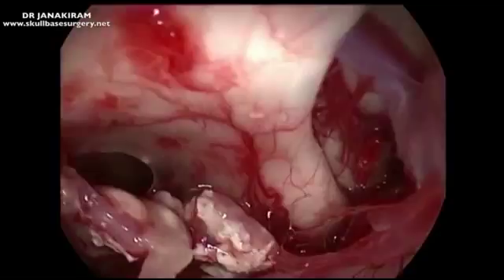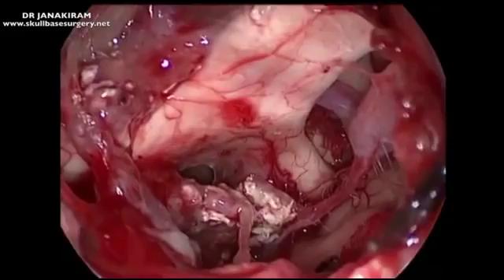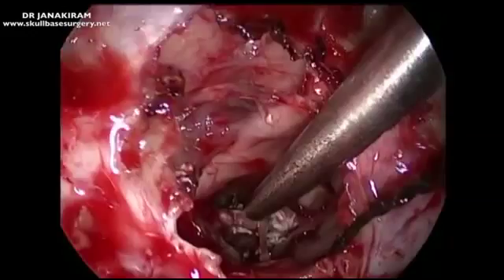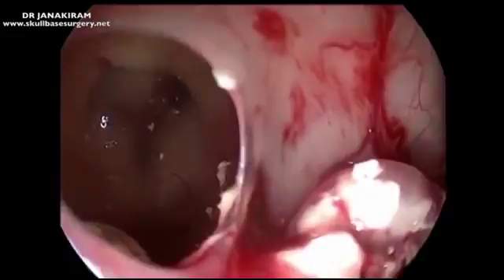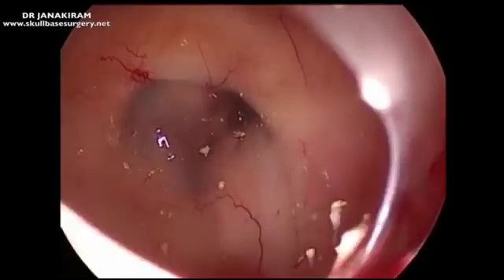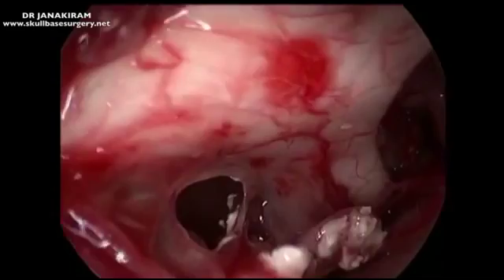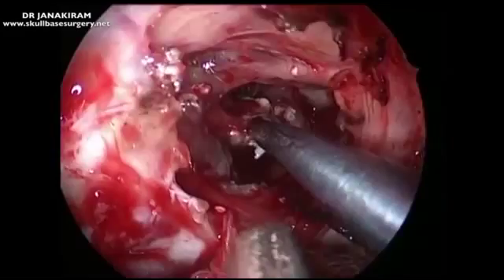Now I am going to look into the third ventricle. It is beautifully seen — the foramen of Monroe and the choroid plexus, very beautifully seen; the thalamus on both sides. There is a very thin layer of tumor there but we will not do anything for that. We could not reach there because we did not have a skull base handle — it would have definitely helped us in the whole dissection.